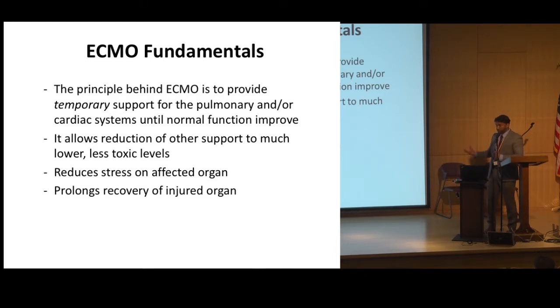Due to stress injury, due to a lot of things that we do on the mechanical ventilator. So whether that is, can we decrease the FiO2? Absolutely. Can we use adjunct therapies like nitric oxide, things like that? Absolutely. Can we lower the pressures on the ventilator? For sure. So that's just from the respiratory perspective.